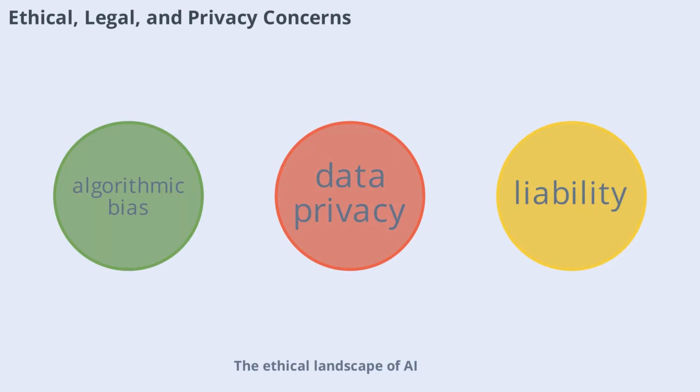The ethical landscape of AI in radiography revolves around beneficence, justice, transparency, and autonomy. Algorithmic bias can perpetuate healthcare disparities if training data is unrepresentative. The black box problem undermines trust and informed consent, while over-reliance on AI threatens professional autonomy. Legally, assigning liability for AI-driven errors is complex, involving clinicians, institutions, and developers.